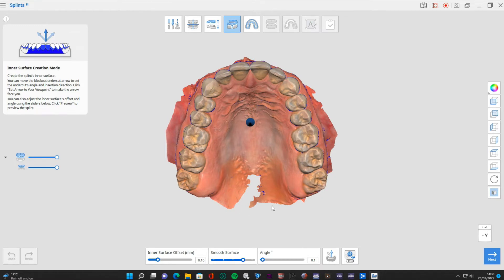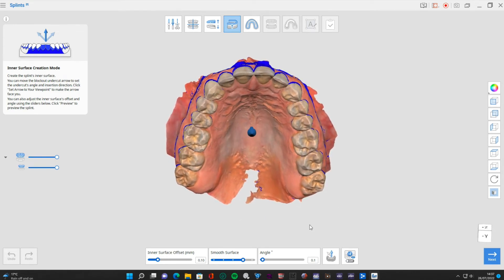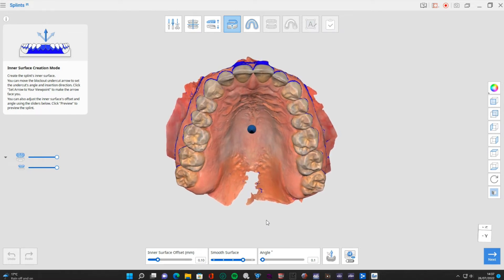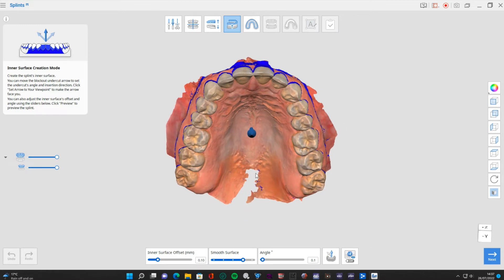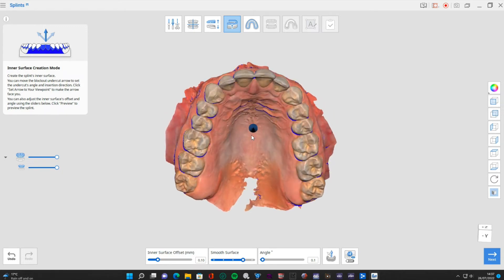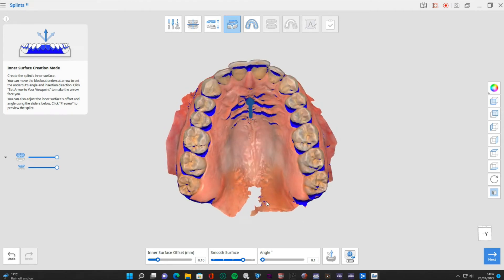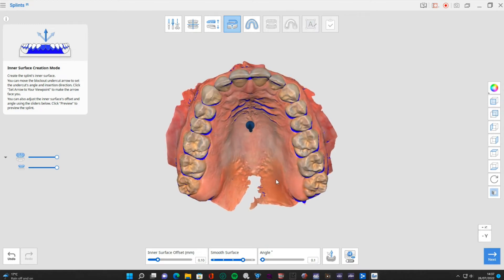This is where we're going to block out any undercuts. If you've used splint software or surgical guide design software before, this will be familiar. I'm going to tilt this in the direction I want to insert the final splint - getting over these anteriors a little bit more than it's suggesting, because I don't want a lot of undercut in front of these teeth. I don't mind a bit more undercut towards the posteriors. Click 'set arrow to your viewpoint' and you can see it's adjusted the undercut - I can fine-tune to find a happy medium.